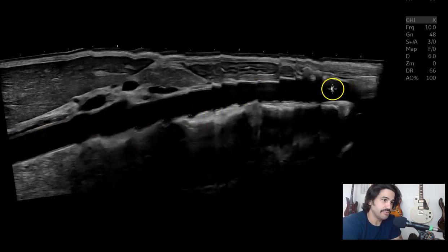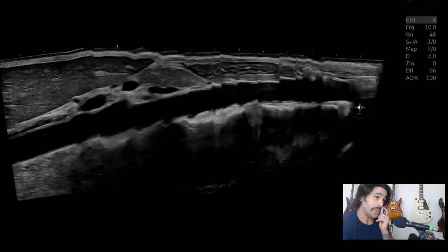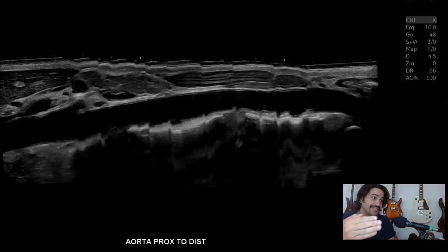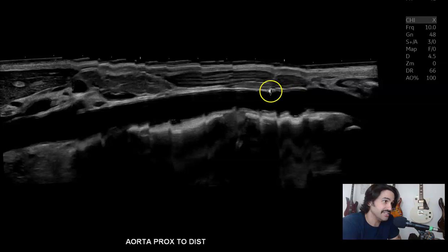I tried to get fancy and do a logic view — a panoramic view — of the entire aorta. You can see it's very clear, there's nothing inside the aorta. But as the aorta is always pulsating and you're trying to do a logic view, you're not going to get a perfect panoramic. The second time I went a little faster, trying to anticipate the beats. The anterior surface of the artery is pretty clear; the posterior surface, not as much. Here you see some bowel in front of it — if that bowel had gas, it would definitely obscure that part of the aorta. So I just wanted to show you my protocol of the aorta on the GE Logic E10, which is just an amazing machine. The imaging you can get with it is fantastic. Hope you guys found this useful.